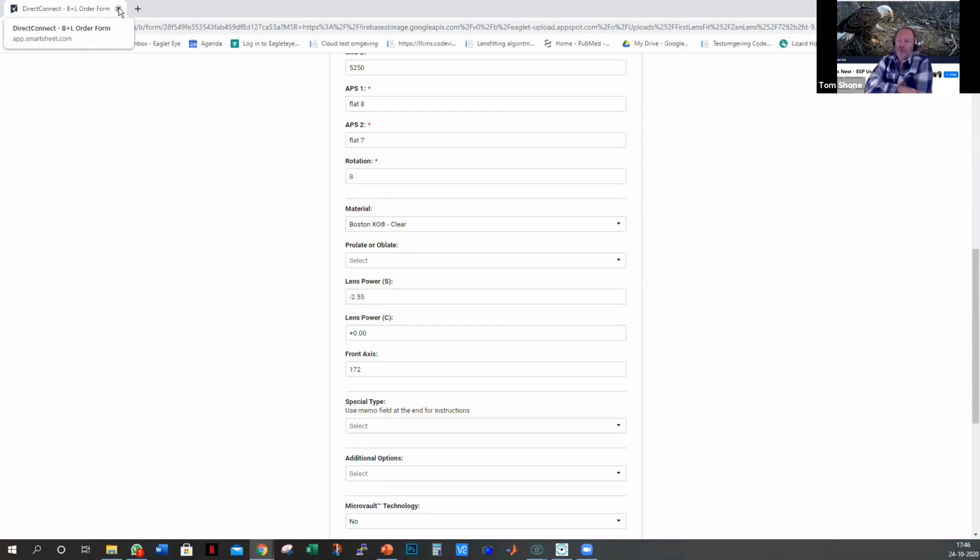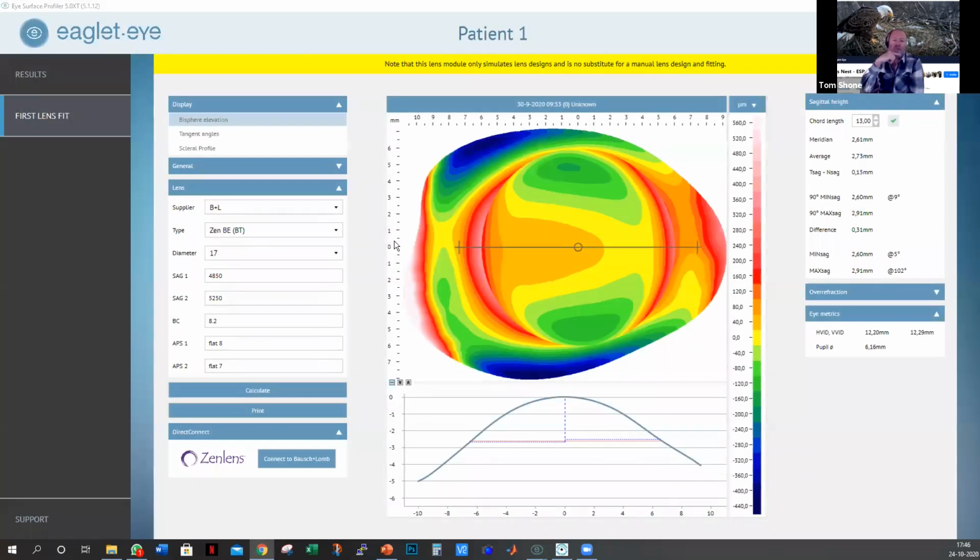Right. And Reinier, most of the labs, if not all the labs, have a copy of the software in their lab on the consultation desk, and they can then bring up the MSR file, which shows them exactly what you were showing us a couple minutes ago. So they can look at that. They've been trained in this, and if you've got questions, they can say, well, maybe this, maybe try that. They're there for you. They can do anything you need.